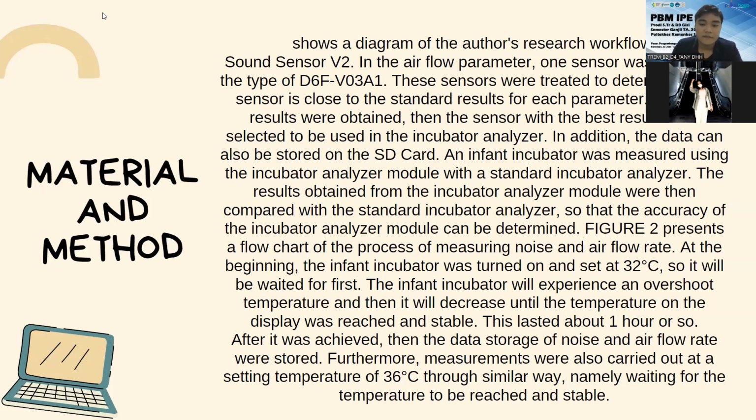After it was achieved, the data on noise and airflow rate were stored. Furthermore, measurements were also carried out at the setting temperature of 36 degrees Celsius in the same way, namely waiting for the temperature to be reached and stable.